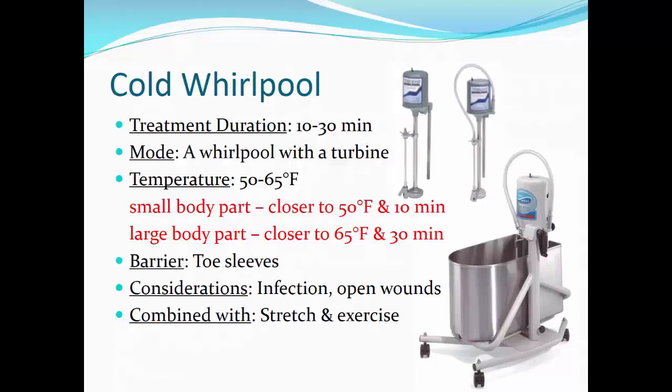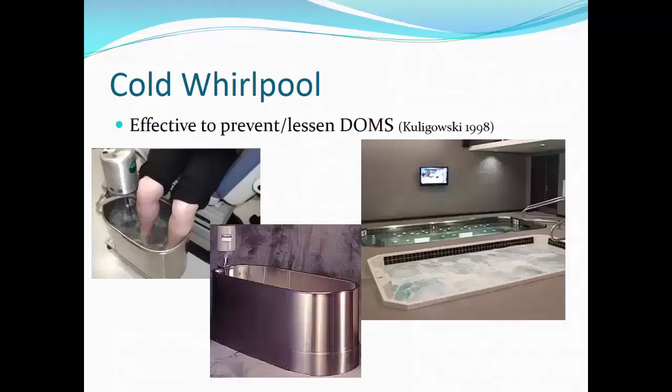The treatment of cold whirlpool is often combined with stretch and exercise. Common exercises include ankle ABCs, circles, and ankle pumps. There is some research that has documented the effect of preventative cold whirlpool use on post-exercise to help prevent or decrease the effects of delayed onset muscle soreness, or DOMS, post-exercise. Cold whirlpool treatments are very common post-exercise among collegiate and professional athletes. The picture on the right is of the Major League Baseball Chicago White Sox hydrotherapy area. Many teams have dedicated significant resources to cryotherapy rooms.